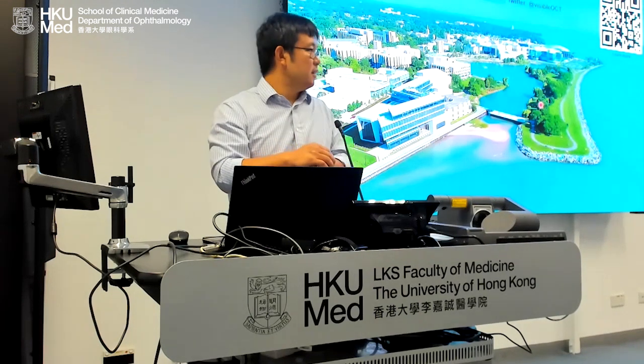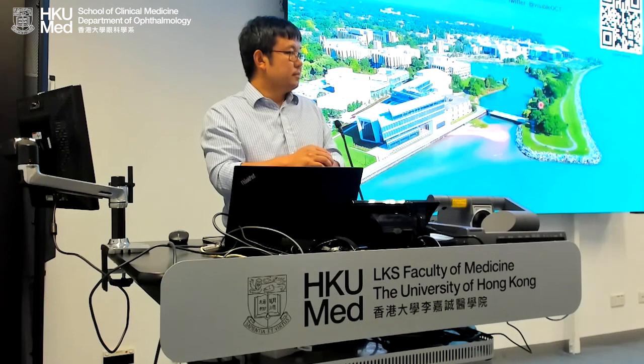Right. So from the work that we did here, retinal nerve fiber optical texture analysis, which allows us to see the bundle structure of the retinal nerve fiber layer, we see that in human eyes, the retinal nerve fiber layer can be visualized in different bundles, different layers of bundles. And now we don't have a human eye here, but in the animal eyes we see, do you think it's not two layers, but in fact different types or different architecture of the collection of the bundles? You have a collection of fibers denser in the upper layer at certain locations, and then the next pile would be a collection of bundles which is denser in the inferior layer. So you think it's an architectural arrangement rather than having two layers of bundles?